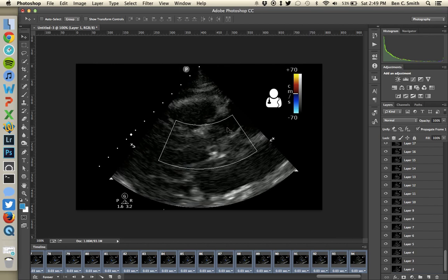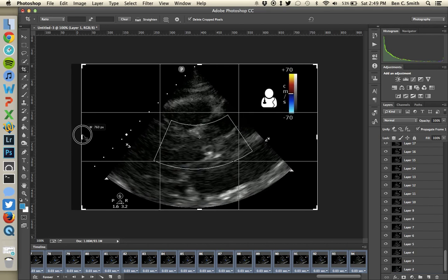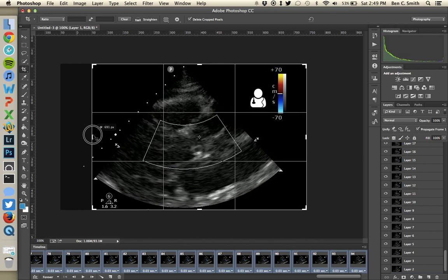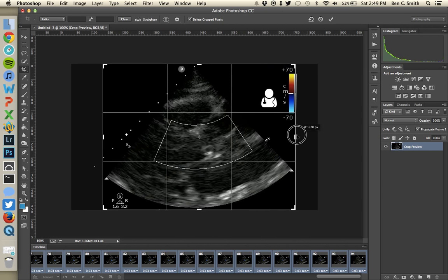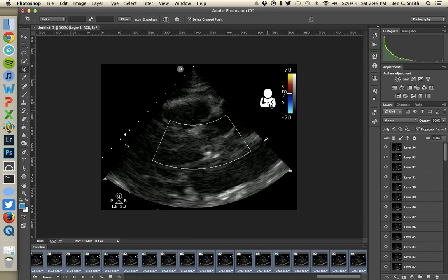Often you'll have an ultrasound clip where you want to crop out some of the image — I've got extra black space on the sides, and you may also have HIPAA information at the top. To crop, hit the C key or click the Crop tool. Pull the crop handles in to just the ultrasound information you want to keep. I'll leave my Ultrasound of the Week icon in there. Once you've got the area you want, just hit Enter and it'll crop to your selection.